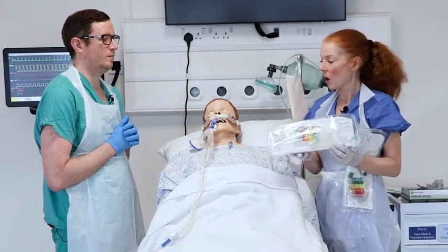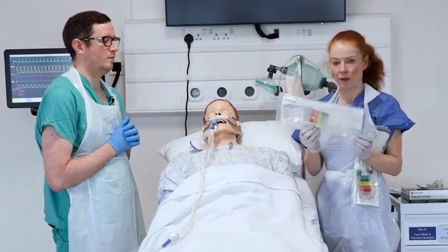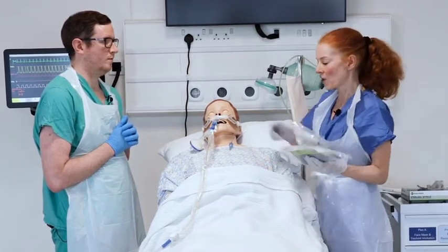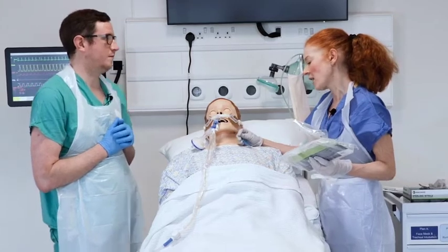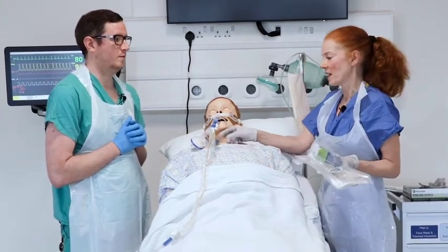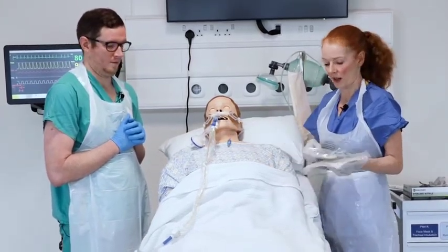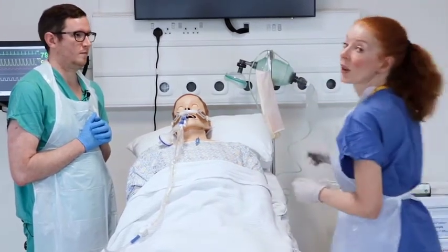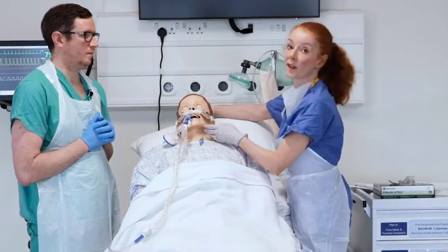Here I have a size 12 gauge suction catheter. For this patient who has a size 8 tube, he would indeed need a size 12 suction catheter. We are now going to demonstrate the technique of suction.